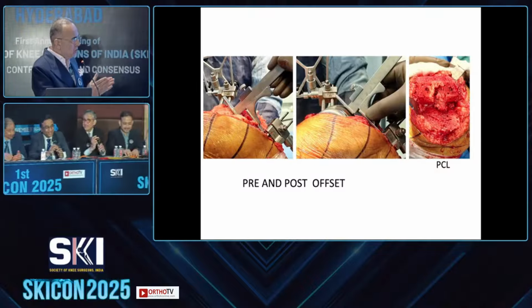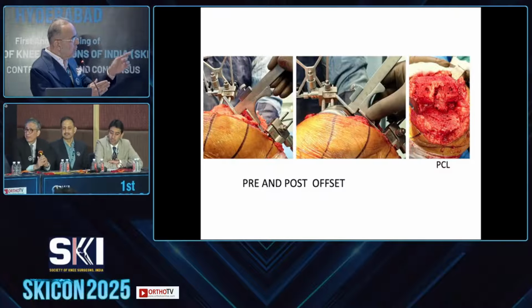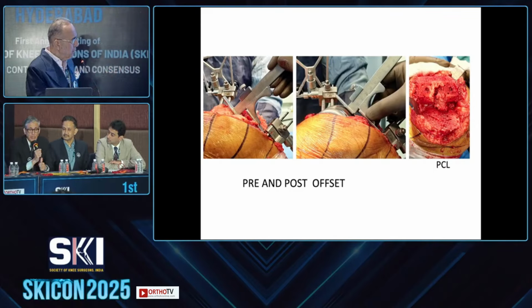Sachin, you're a master arthroscopist, and I'm sure you reconstruct PCLs. Why would you take off the PCL in an MP knee? There is no need for you to do that. That is the first thing. If you are able to balance the PCL properly, as well as what Dr. Rajgopal or Guruva does, you can leave the PCL behind. There is no kinematic conflict.